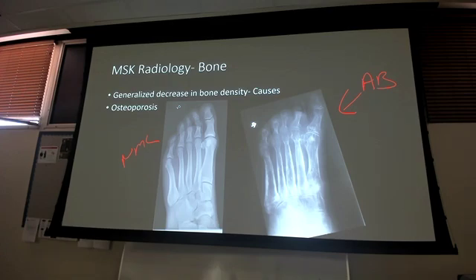Right? So when you shoot a foot, their foot is sitting here and it's just coming down on the top and the plate is underneath the foot. Okay, so the R was backwards. Yes, why was the R backwards, right? The R is backwards just because depending on the position they have, maybe that just came across and they had to flip it. That's why I talk about how the text is always going to flip it to the way that you need to see it.